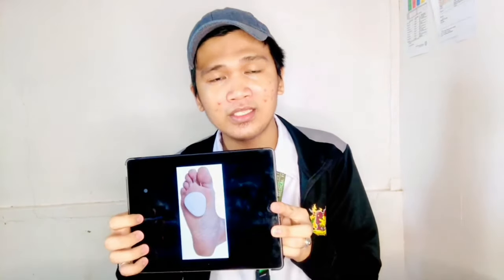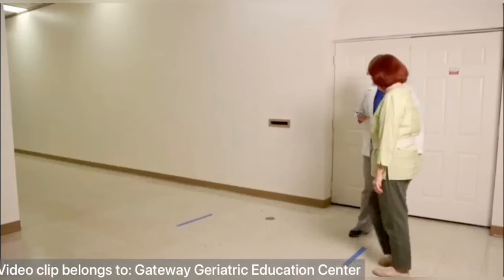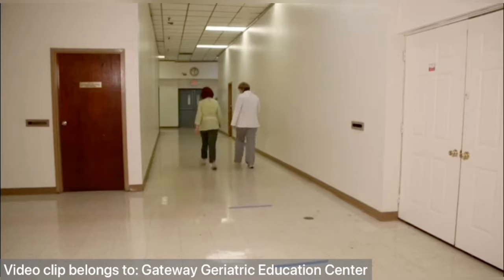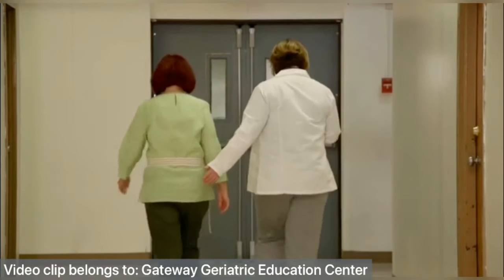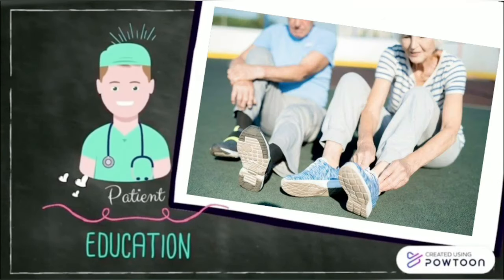— your patient would need an external shoe modification such as a rocker bar and a metatarsal pad. As physical therapists, we also need to educate our patient about safety and proper orthotic use. The patient must know how to perform with maximum safety in order to prevent falls, which may produce additional injuries. The patient and family must be made fully aware of the importance of this consideration. The patient must also learn the special skill of donning and doffing the orthosis for independence, and must learn proper skin inspection to regularly check for skin irritation and breakdowns caused by the orthosis.